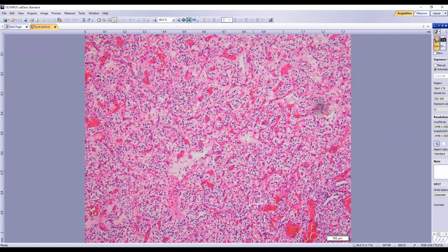Usually, once you see the ovarian type stroma, you don't worry too much about the size, but if you have to go by WHO, previously it used to be anything greater than 1 centimeter. But I think recently they revised it to anything greater than 0.5 centimeters. Okay, got you.